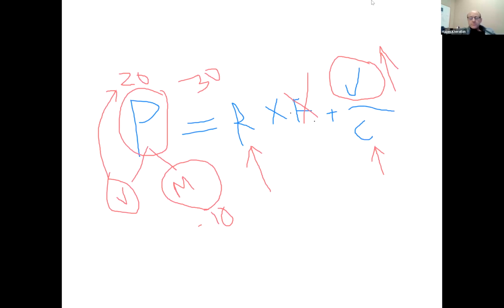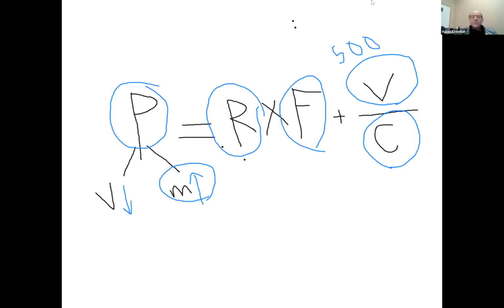In volume control mode of ventilation, that pressure will be contributing to the volume with the machine pressure. So the machine pressure will go down if the patient started to breathe on his own. So the pressure will be variable to give the same tidal volume. If the patient is breathing with the machine, there is no need for higher pressure of the machine, and then the pressure will be lower.